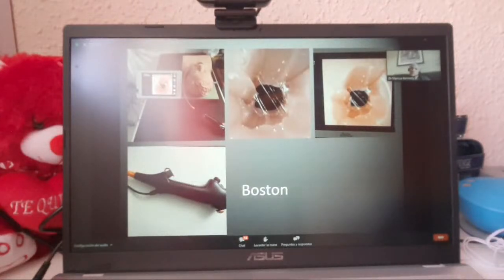So thus, the single-use bronchoscopes have been developed. So this is the Boston single-use scope. This is just images from inside my office with a standard mannequin. So the scope comes with its own screen or monitor, and these screens can be cleaned. So the companies don't allow you to plug the scope into, for instance, a laptop, because you can't clean a laptop down.